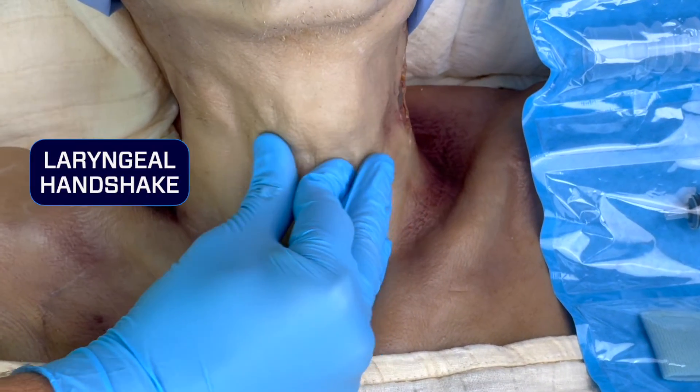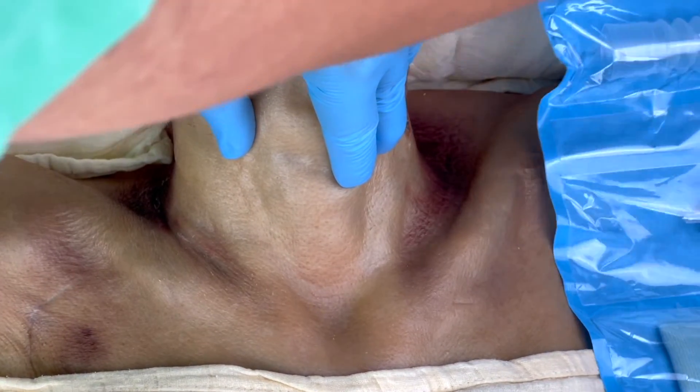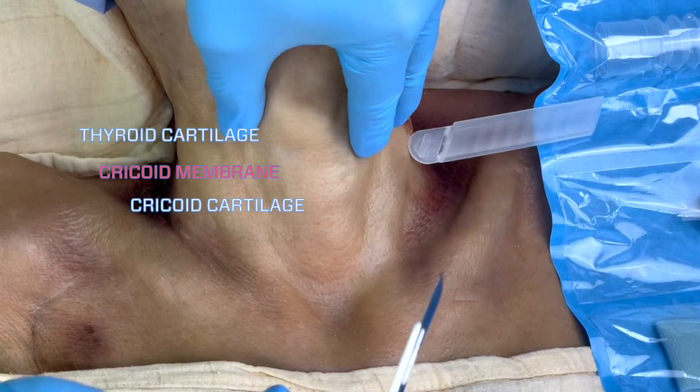Start by identifying your anatomic landmarks: the thyroid cartilage, or Adam's apple, above; the cricoid cartilage below; and the cricothyroid membrane in between.